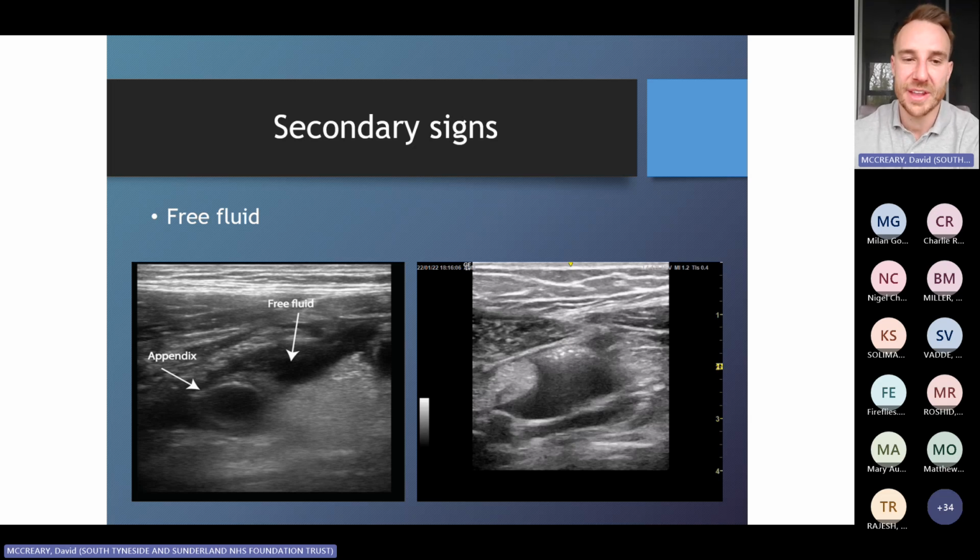And to be honest, more often than not, it doesn't always add up to anything. I've had girls in the department before with complaints about gynecological things who've had huge amounts of free fluid. And then I've had a radiology scan done that same morning, and they just said free fluid, nothing else identifiable. And I remember this one girl, just 3 hours later, she was so much better, completely better. We just sent her home, normal bloods, fairly normal radiology scan that agreed with the POCUS. So I don't think free fluid means everything, to be honest, but a large amount of it, definitely take it into account, but it's not the be all and end all.